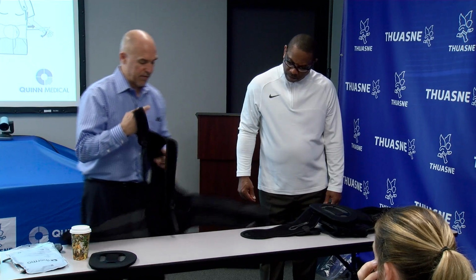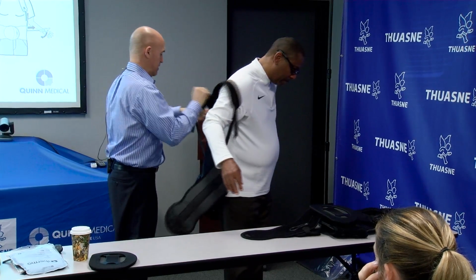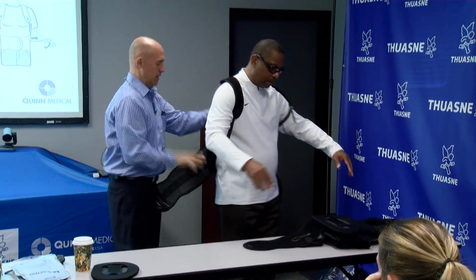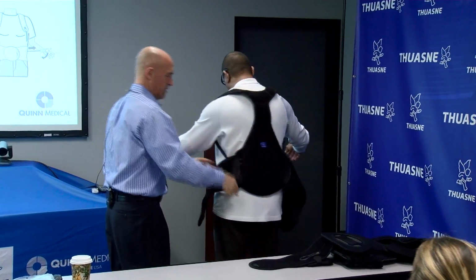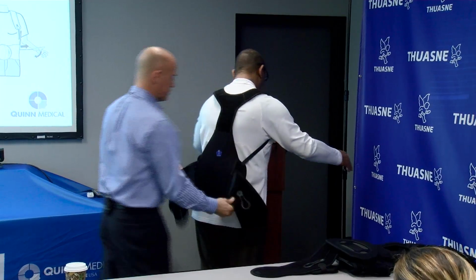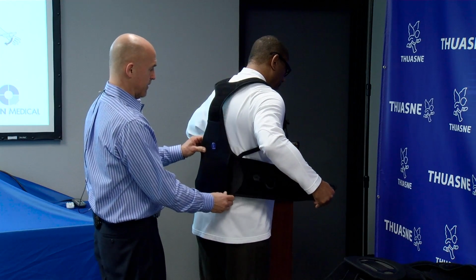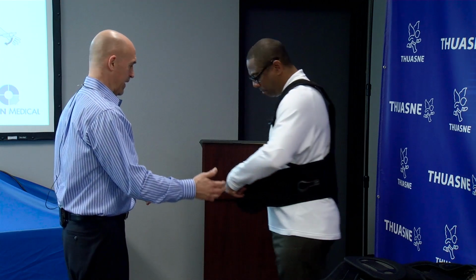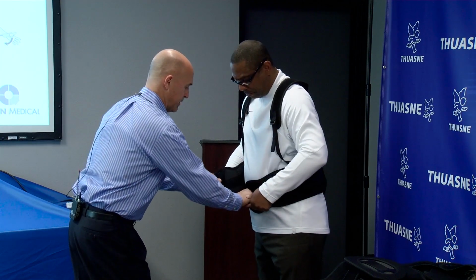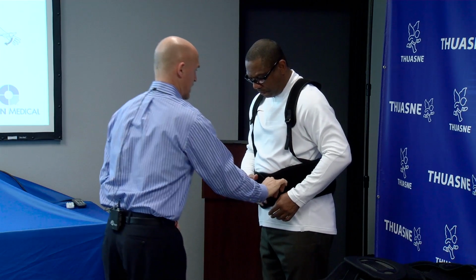So you're just going to have him put this on like a backpack. Here we go. Let's face this way. Actually, face to your right. Let's grab those wings. So you're going to set this in the same spot, just above the tailbone. Okay, now you can face me, and there's no anterior panel, so you're just going to wrap that. You're going to help the patient go like that and wrap like so.